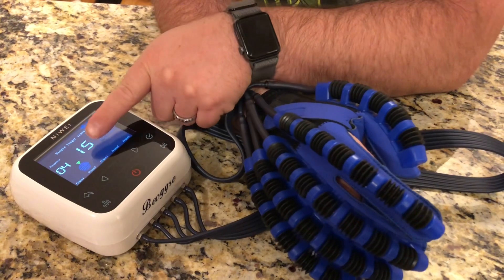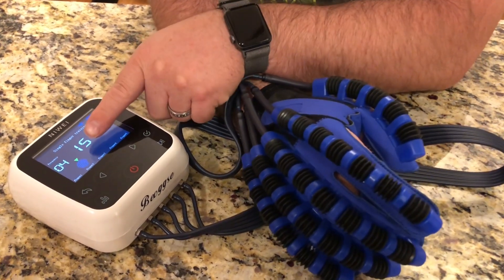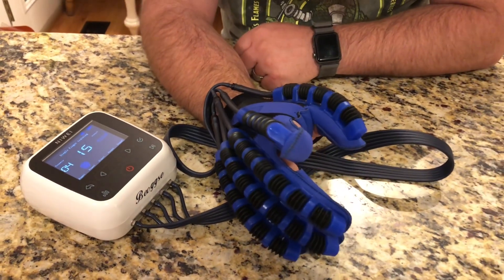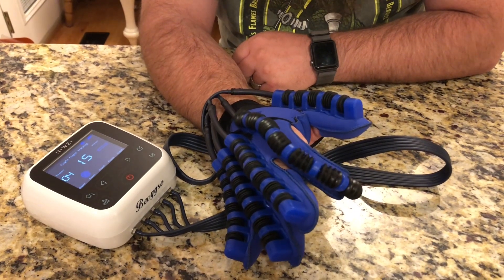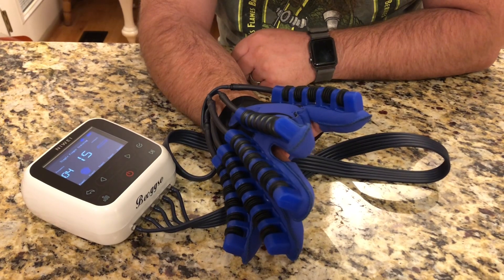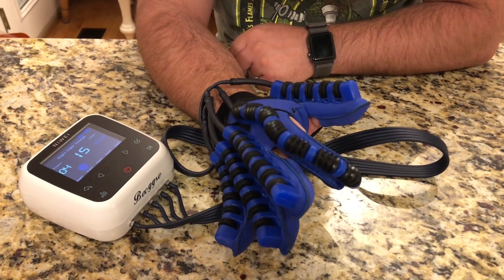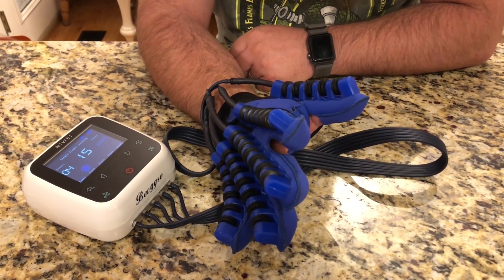For the single finger mode, you can select and turn on and off the fingers that you want it to use. I have just finger number two turned on, then I hit play and you can see it's gonna stretch all of my fingers and then move just the one back and forth — just that one finger, to help stretch just that one.